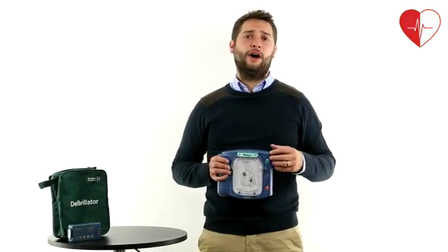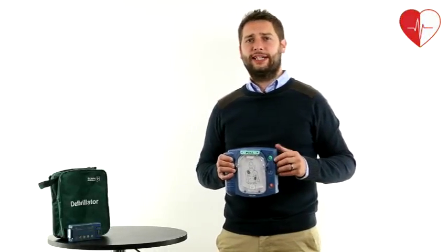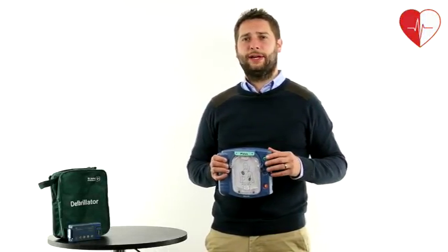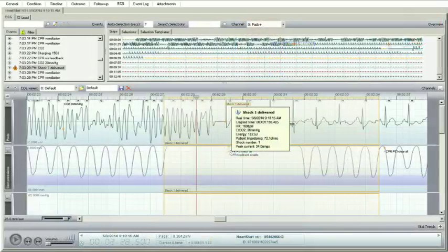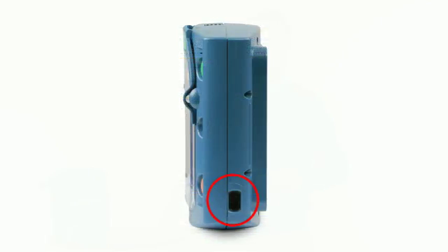With the CPR voice guidance, the Heartstart HS1 is ideal for lay persons with little experience. The unit has a built-in memory feature so that any incidents are recorded and can be downloaded by health professionals via the infrared port.